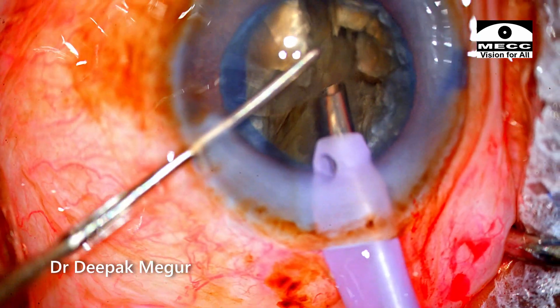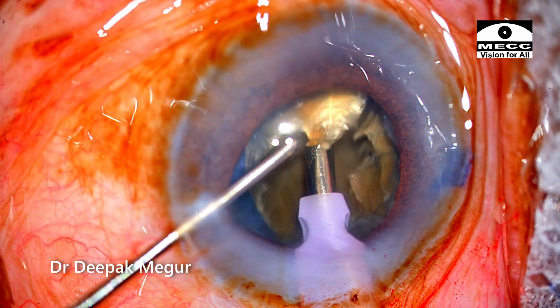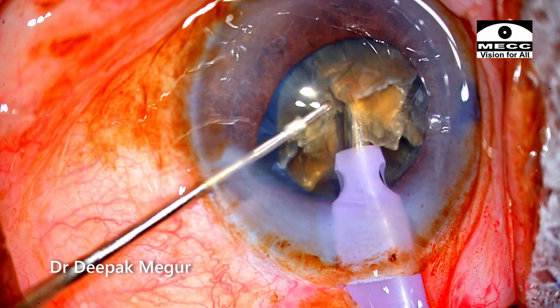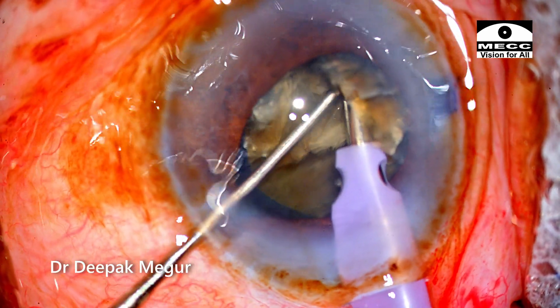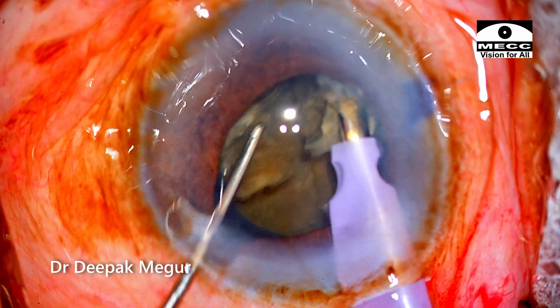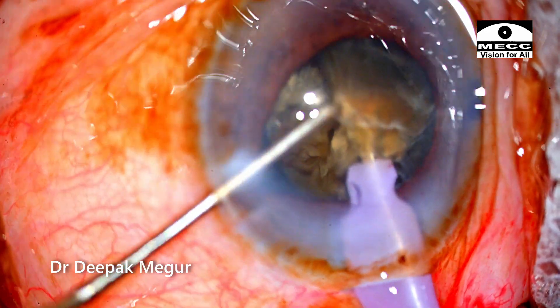It is not wise to keep pulling laterally when it is not giving way, so I go ahead and try to make smaller pieces with each hemi-nucleus. In each of these chopping maneuvers I could get through 75% of the nucleus, but the posterior plate continues to remain attached and is extremely leathery and thick.